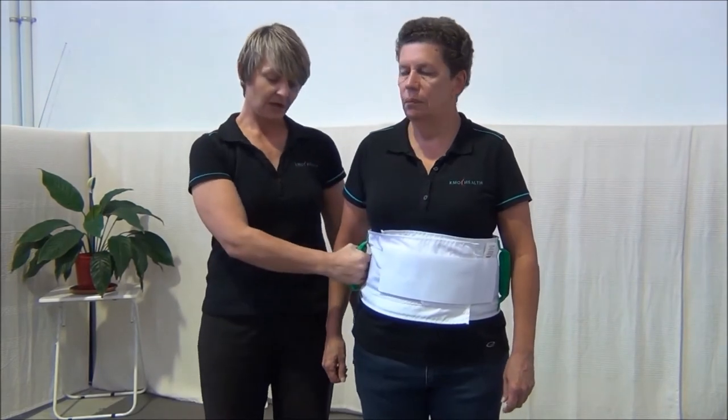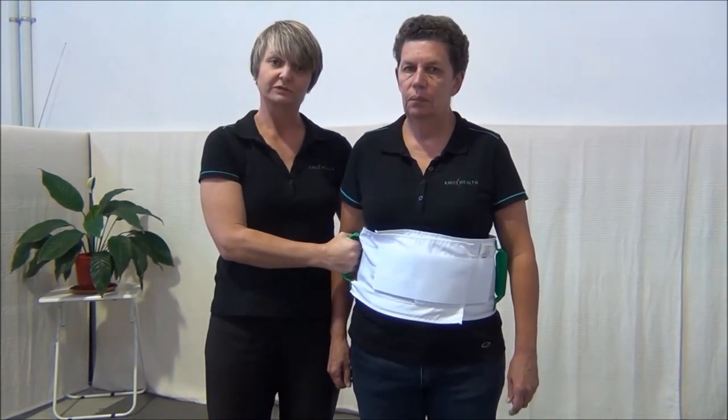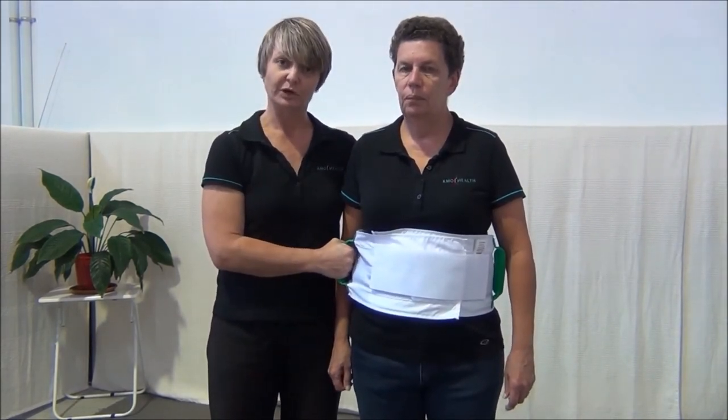Always place fingers only under the front, fist towards yourself, and across at the rear. That is how you safely hold a walk belt.